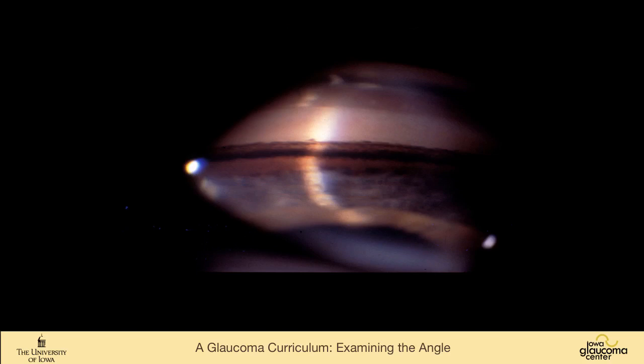This is a patient with pigmentary glaucoma. The insertion here is very deep, E for extremely deep. This is the pigmented meshwork here. Angular width is huge, so 60 degrees or so. It is concave, so this is a C and 4+ pigmentation. So E60C4.